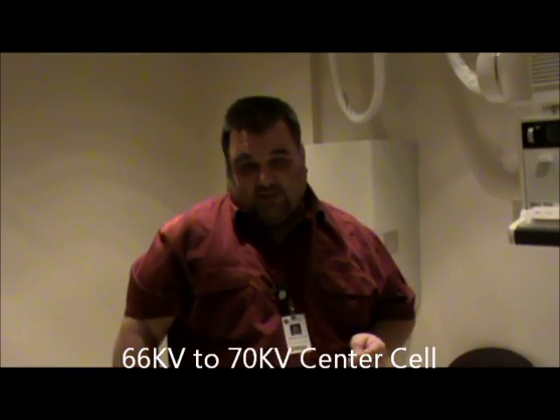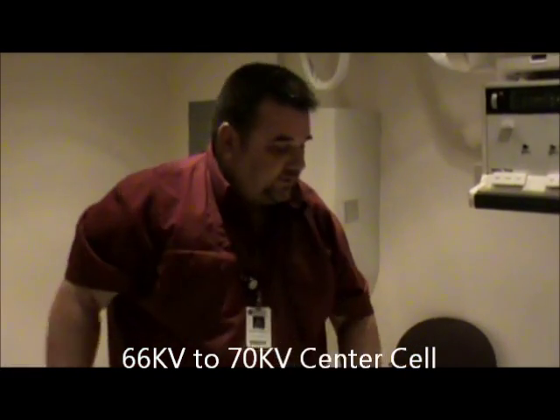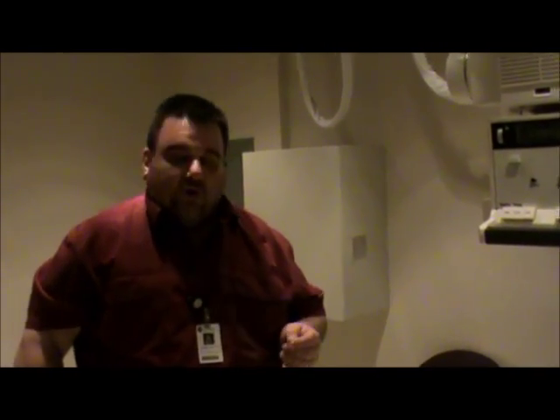Our collimation will be pretty tight. I'm going to change and put my right marker here. The technique does change a little bit — it's going to be about 66 to 70 kV. Our film size stays the same, 10 by 12 lengthwise. Now we can make our exposure. These are our three views for our orbits.